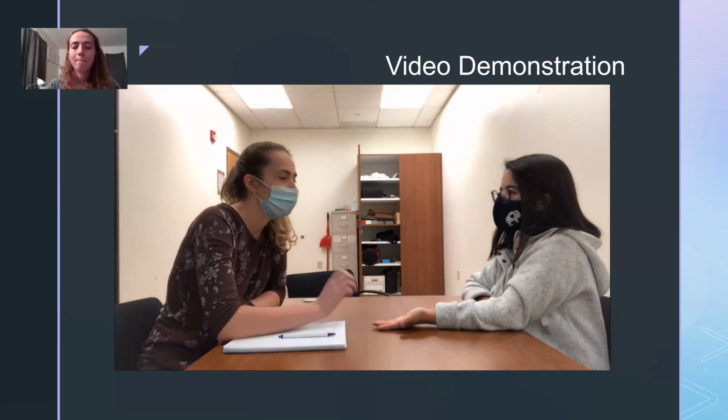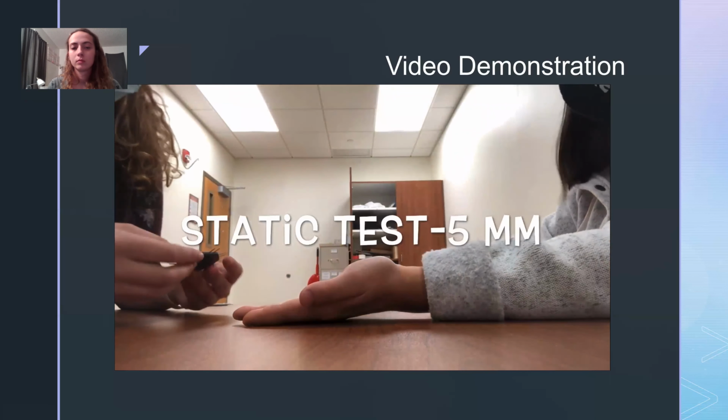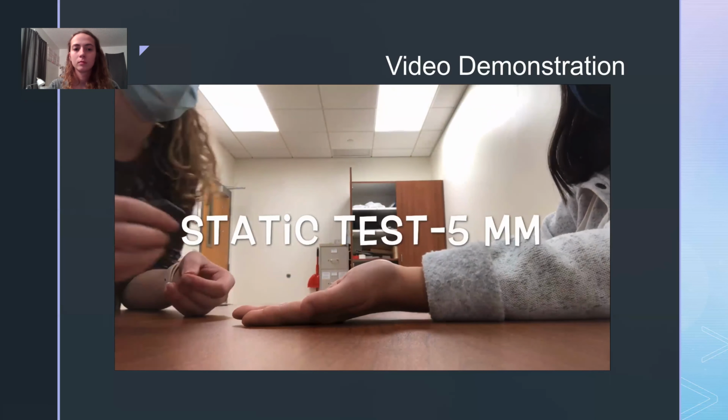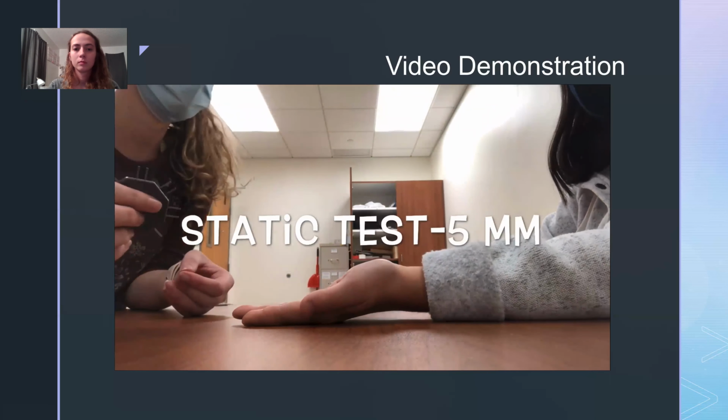Yes. Perfect. All right, Alina, I'm going to have you close your eyes and I'm going to begin the test. You're going to feel it on your pointer finger first. So remember, just say 1, 2, or I don't know.